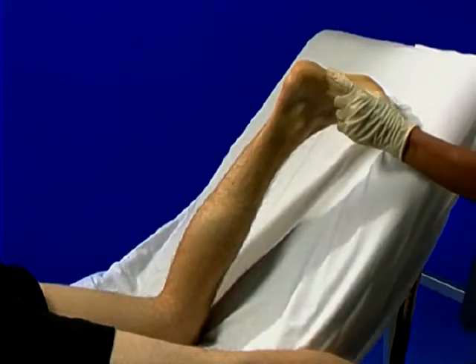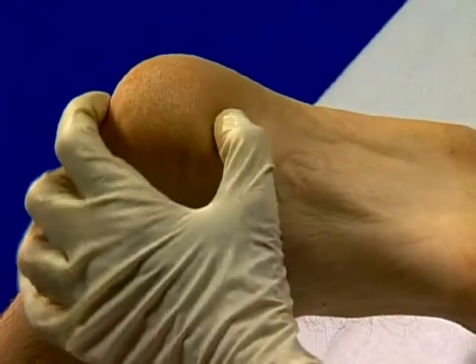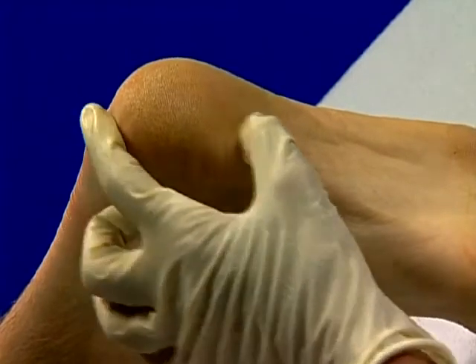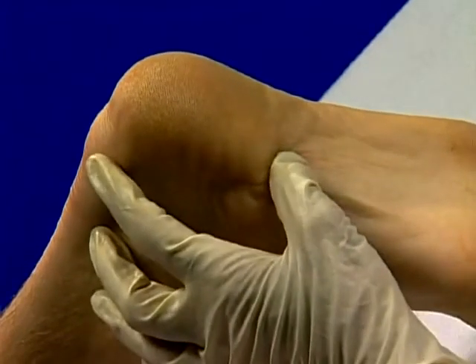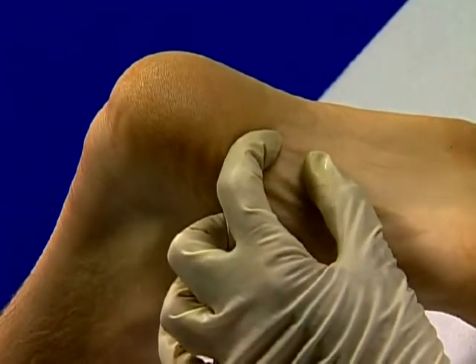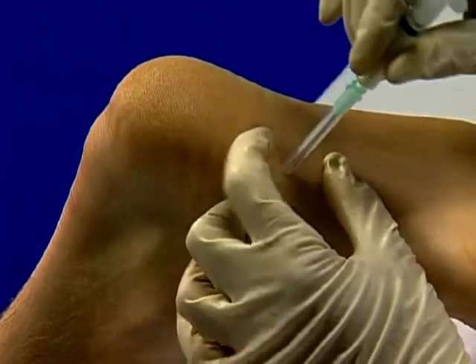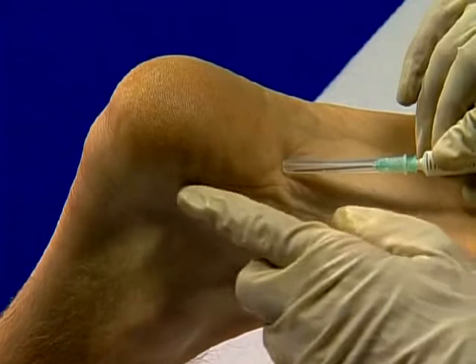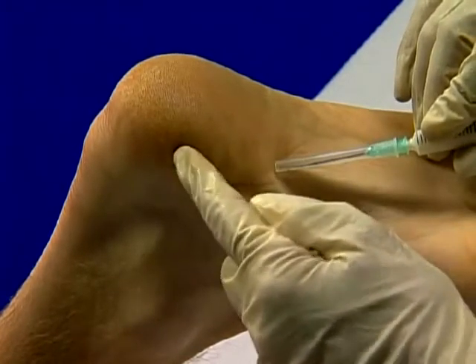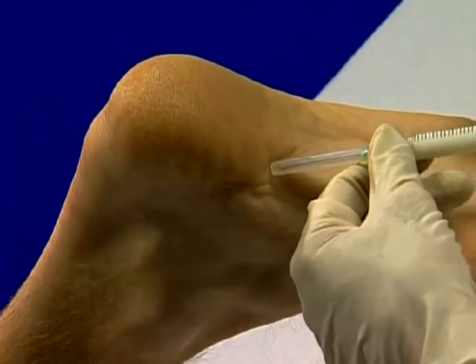Palpate the tender area invariably found on the medial side of the calcaneum. Do not inject through the heel pad, but move distally to the edge of the pad where soft area of sole begins. Mark entry point here, clean and firmly stretch skin, and rapidly insert needle perpendicularly. Slowly angle needle proximally at about 45 degrees until the point gently touches bone. Pepper along the enthesis.